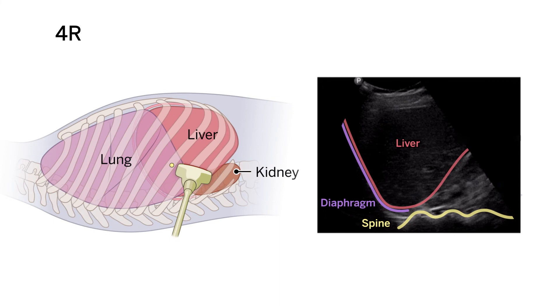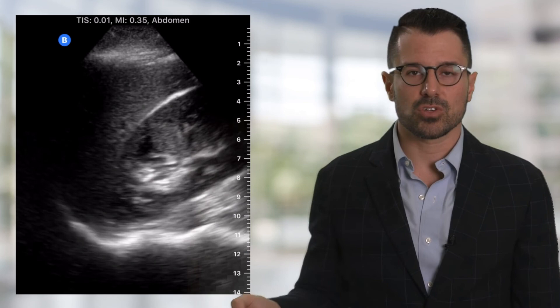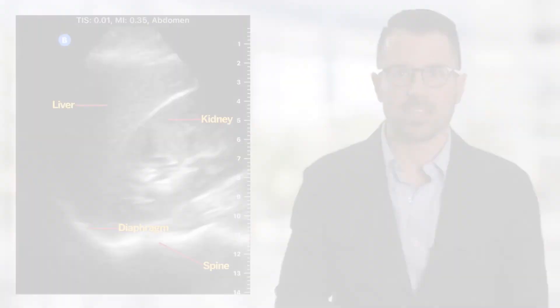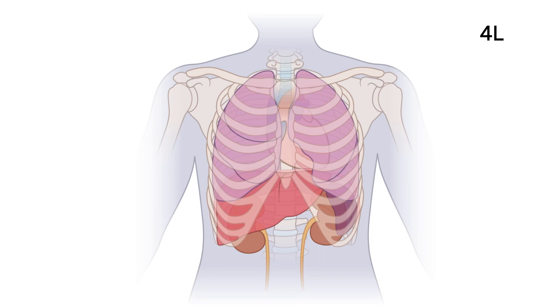It should look like this: picture those bright ridges in the far field of the image — the spine — giving way to the curvy diaphragm coming off the top, which should be bright and hyperechoic, with the isoechoic or gray liver and kidney pictured right there. On the left, it should be the exact same thing, except now you're looking at a spleen instead of a liver — an isoechoic spleen, bright ridges in the back which are the spine, giving way up to that curvy hyperechoic diaphragm.